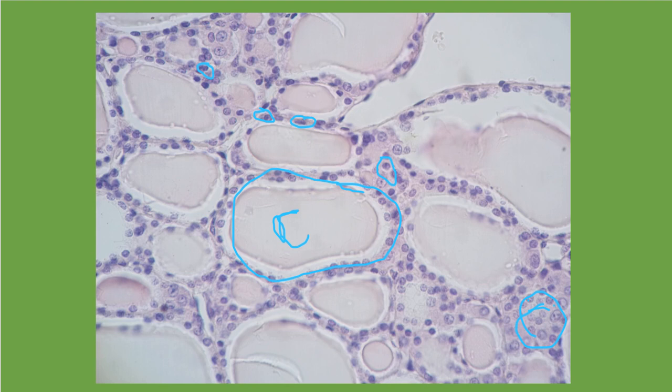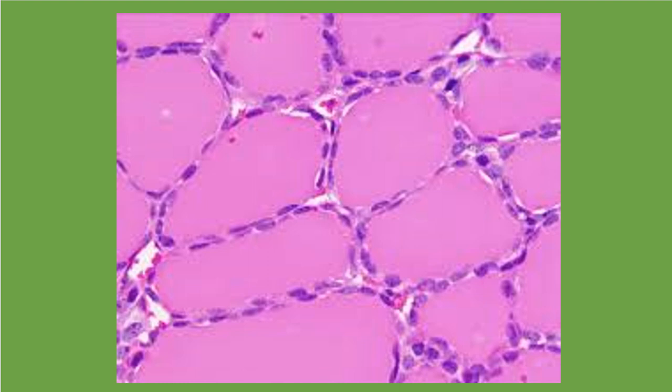Let's see. Did we look at this picture? Yes, we did. Oh, this was a perfect picture of the follicular cells, the follicle and the colloid that you can look at here. This region here would be our parafollicular cells.